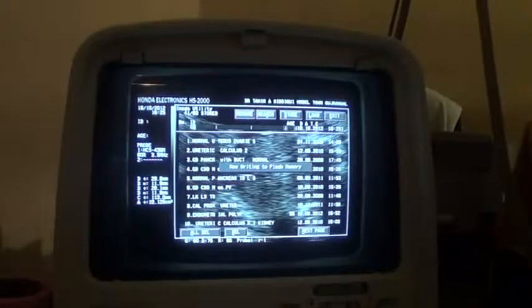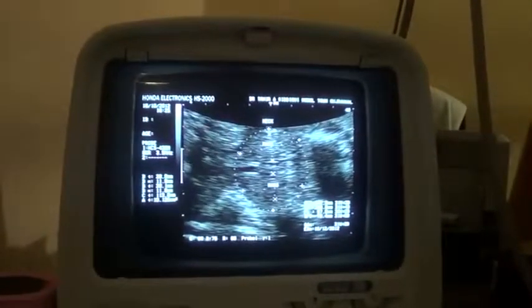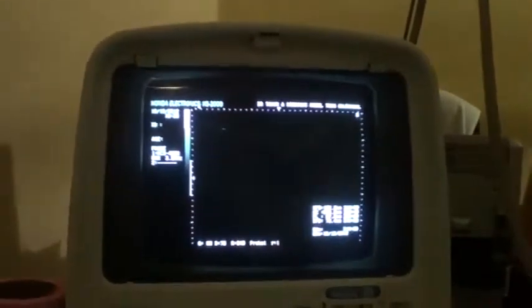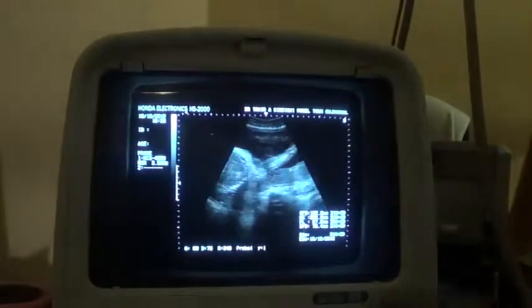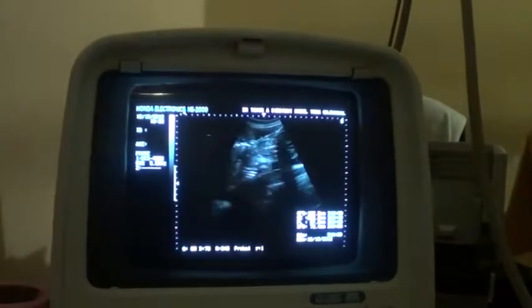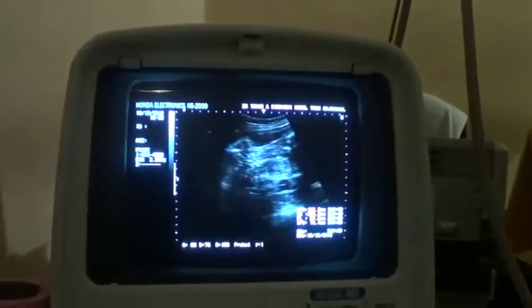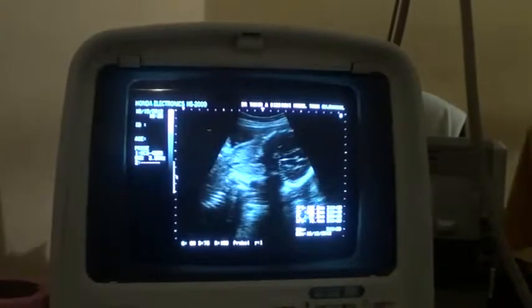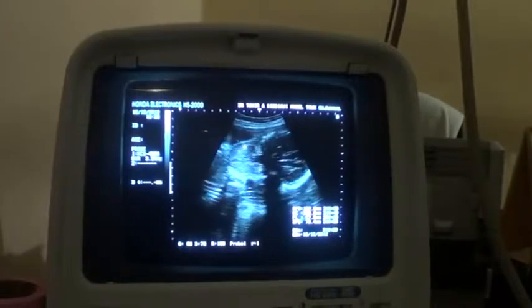And this is the reason for the fetal activity that we saw the patient was showing her, seeing the fetus to be much more active than expected normal. This is the head, again a short review: the mass, the head, the bilobe mass, the chest.